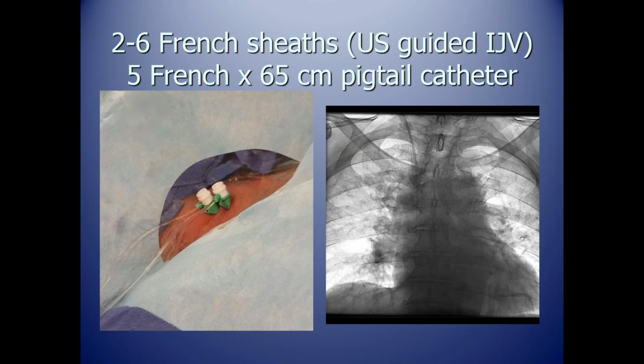And there have certainly been reports in the literature where people are doing a fair amount of manipulation to get the catheters into the pulmonary arteries, and then a chorda can snap. And so I do like the atraumatic use of the pigtail catheter.